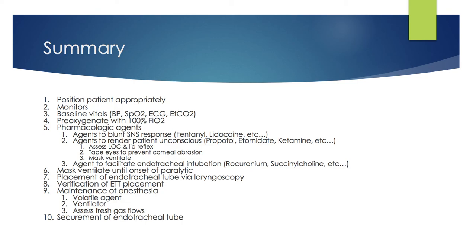After placement has been confirmed, plan for the maintenance of anesthesia through the administration of a volatile agent, appropriate ventilator settings, and assessment of fresh gas flows. Finally, secure the endotracheal tube.